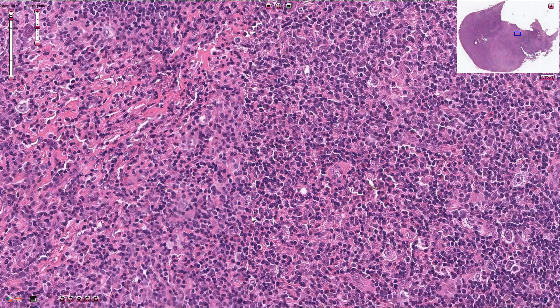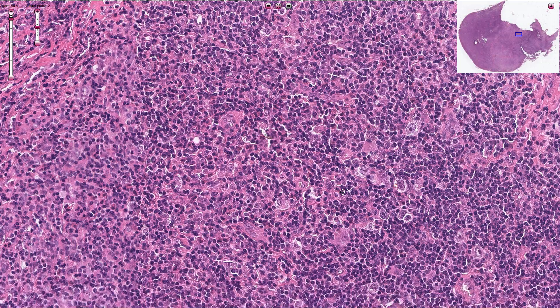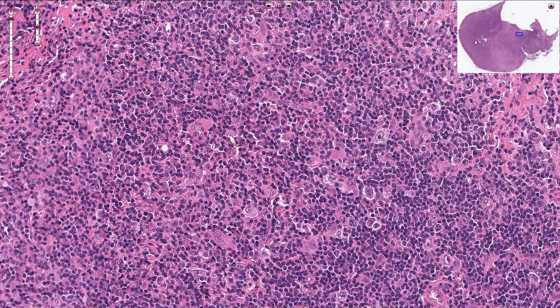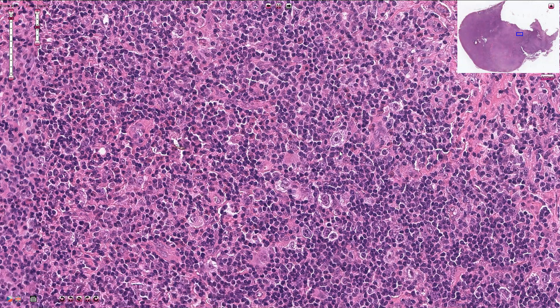The malignant cells — Hodgkin cells and Reed-Sternberg cells — have a typical immunohistochemistry profile. They are CD30 positive with membranous positivity and also Golgi apparatus positivity. CD15 is also very commonly positive; however, these cells are negative for CD45, or common leukocyte antigen.